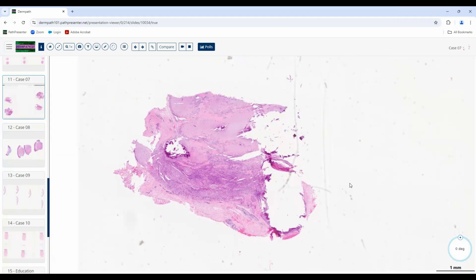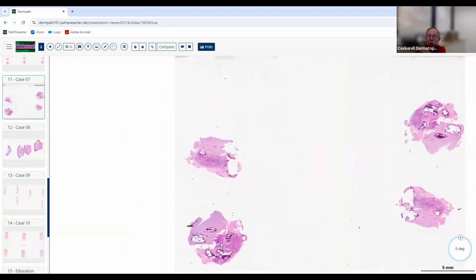Okay. So it looks like an excision, like deeper tissue. From afar it looks kind of disorganized, like a neoplastic process. But then we do see more hypocellular and more hypercellular areas. The hypocellular areas have these blue, almost pinkish areas. They almost appear kind of cartilaginous. So once again, this might have been an enucleation type procedure. They might have thought this was a cyst or something, right?